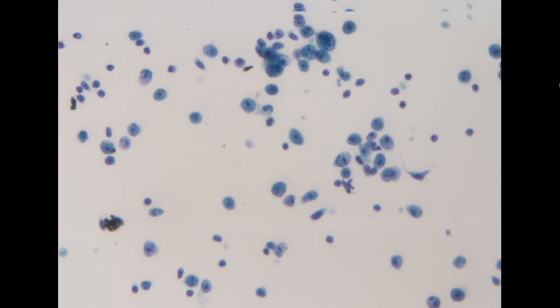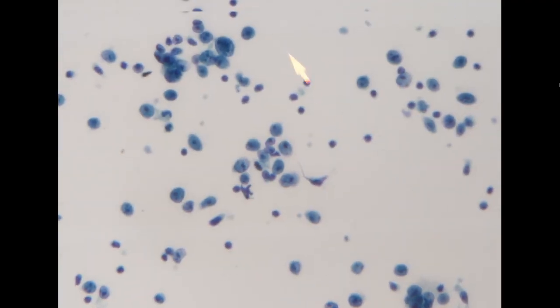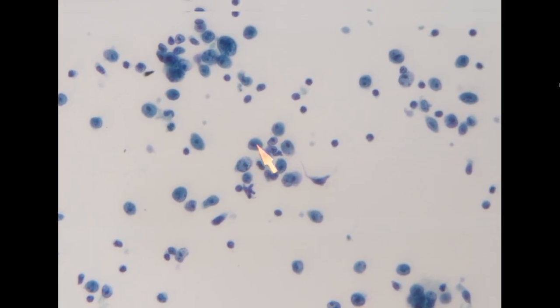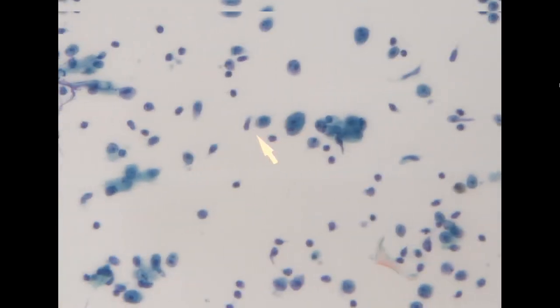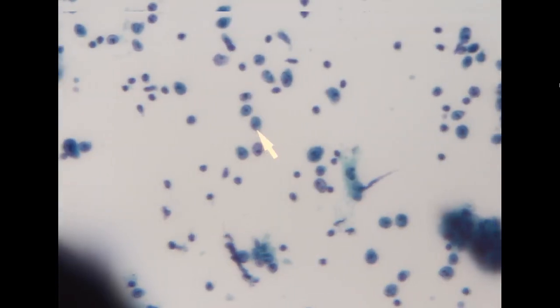So we see mostly individual cells. In the background, we can still appreciate some reactive, mature lymphocytes. But if you compare the size and the shape with these highly atypical enlarged cells with prominent centrally located nuclei, these cells are definitely abnormal and big, and they show high-grade morphological features.